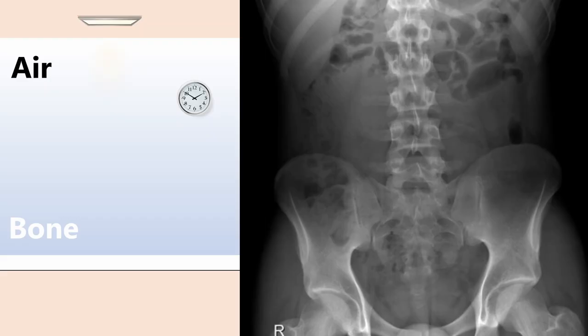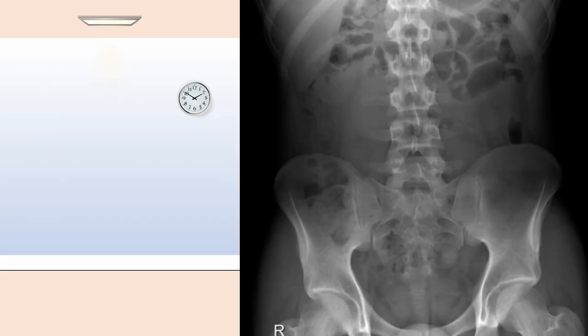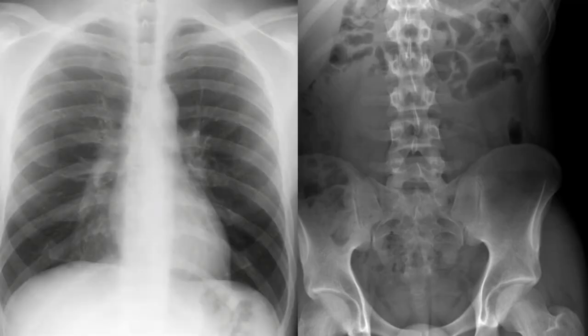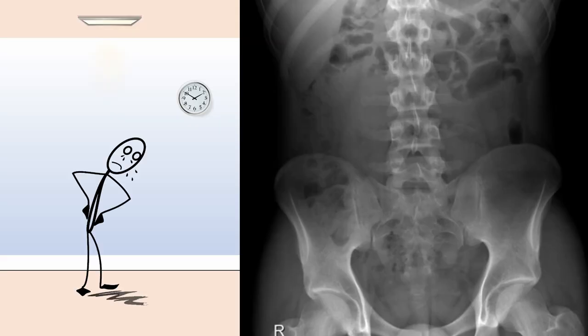Soft tissue and fluid are less dense than bone and appear slightly less white. Fat is less dense still, appearing slightly less white than soft tissue. It's important to realise that the abdomen often contains very little air, making it difficult to identify soft tissue structures. In a chest x-ray, air acts as natural contrast to surrounding soft tissue, making it easier to identify structures. This is a big limitation of abdominal x-rays and a reason they are performed much less frequently than chest x-rays.